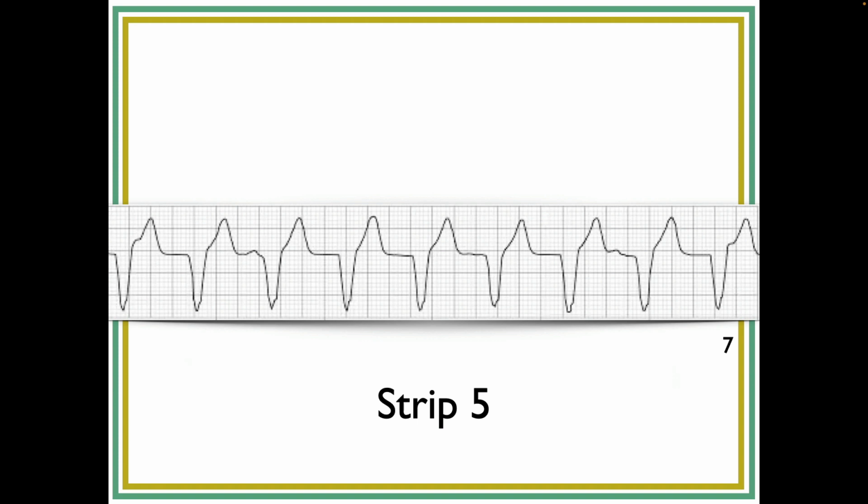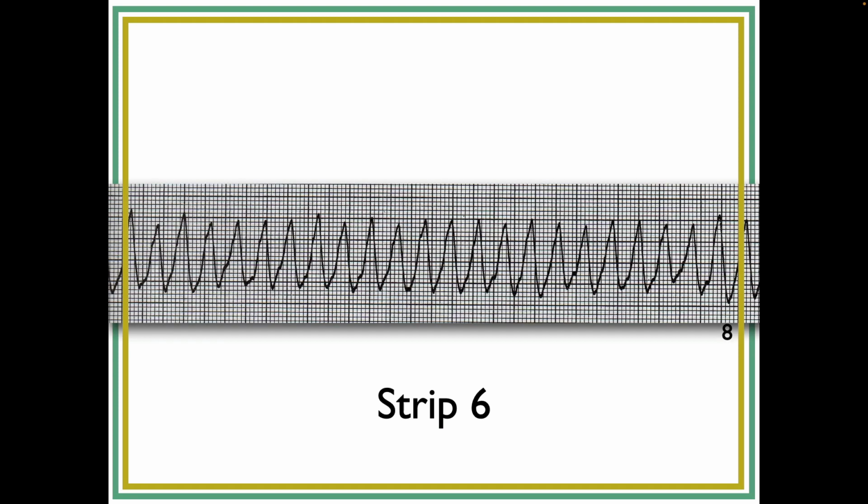Okay, so what's the bottom cutoff for accelerated versus ventricular escape? When does it become accelerated? Between 40 and 100. Yeah, 40 and 100. So the one here is accelerated idioventricular rhythm, AIVR. The one in the handout is right on the border, so it's kind of a problematic one. Okay, but this one I think is the same.